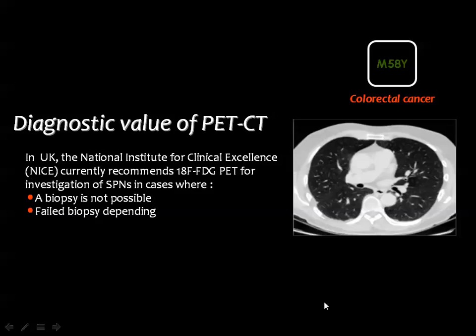Now it's very important to say that pulmonary nodules, to be sure that this nodule is malignant, we usually want to have a histologic proof by imaging guided biopsies. But sometimes the nodule is not reachable by CT guided needle biopsy.